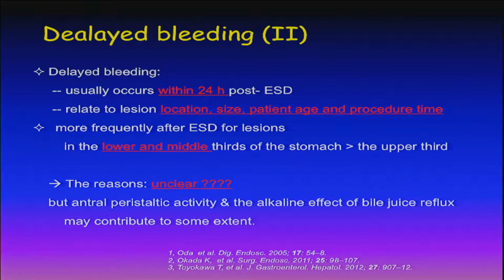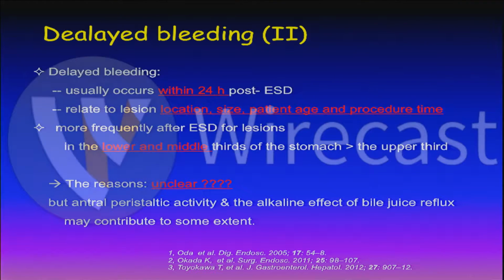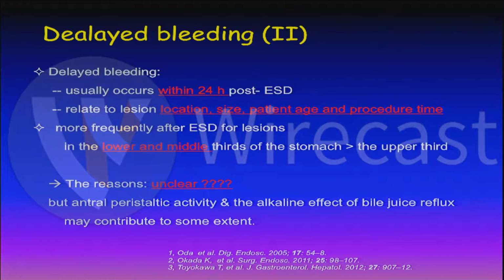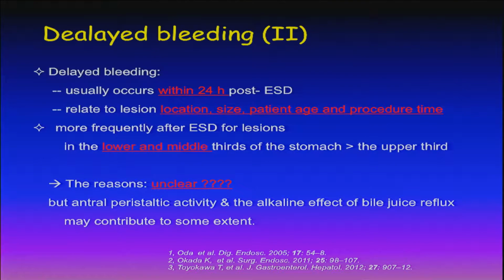Related to the lesion location, size, patient age, procedural time. Ironically, the bleeding more frequently after ESD in the lower and middle third of stomach is higher than upper third. The reason is uncertain.